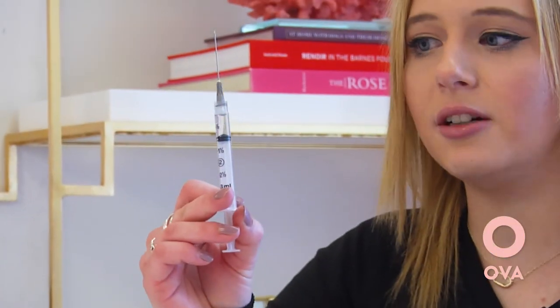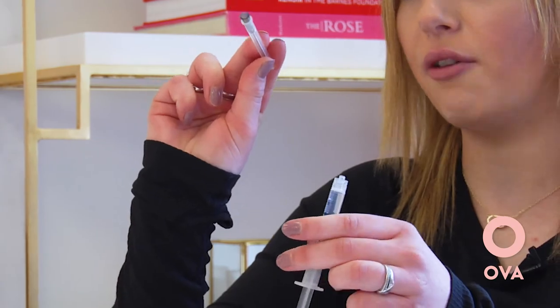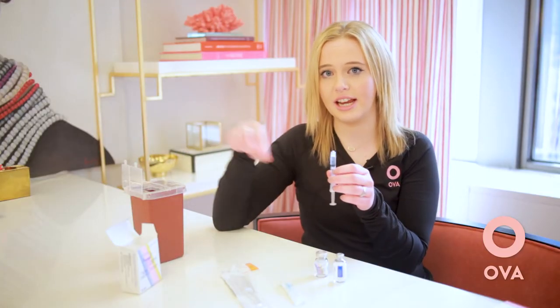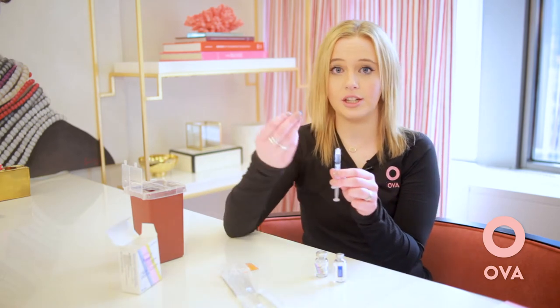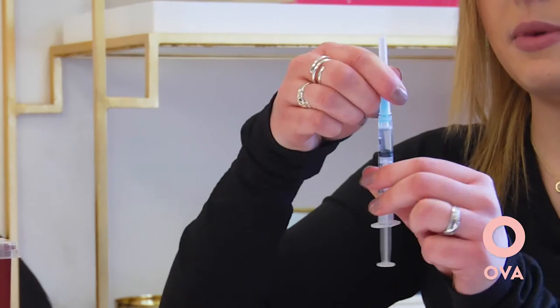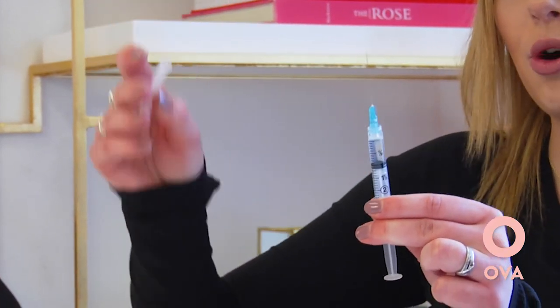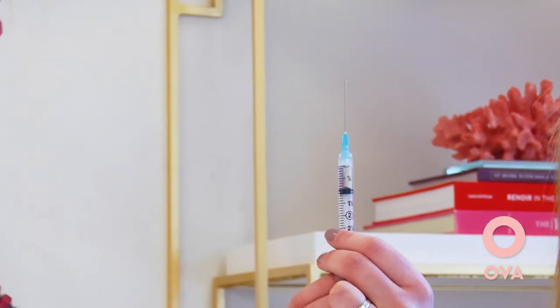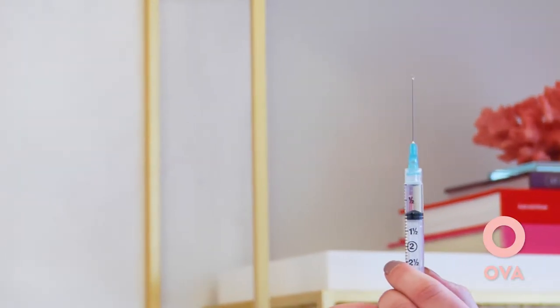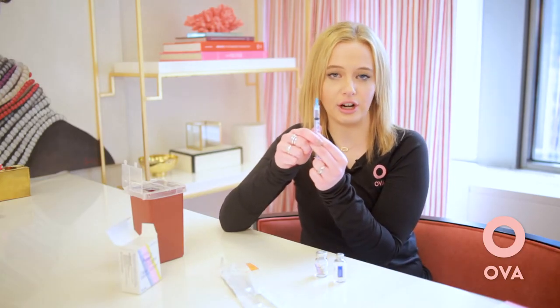Take that out of the vial, then recap this needle, twist it off, and it'll go into your sharps container. Take the other needle and twist it on, making sure it's on there tight so the medication can't seep out the sides. Pull this cap off and before you get ready to administer, push up ever so slightly to see that little drop of fluid on the top. That means you're priming the needle, getting it ready for administration.